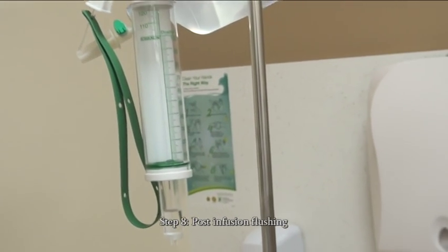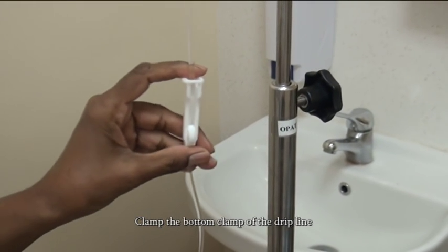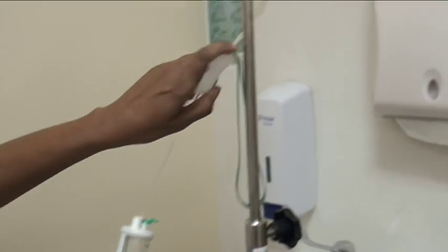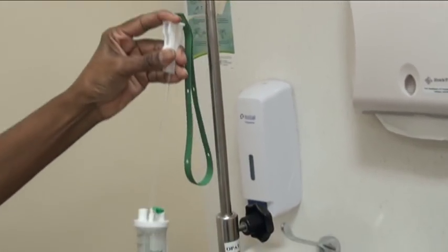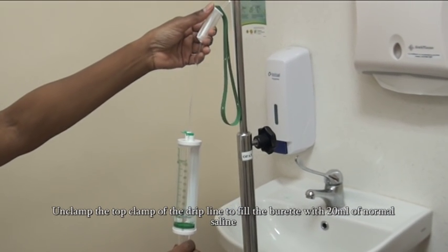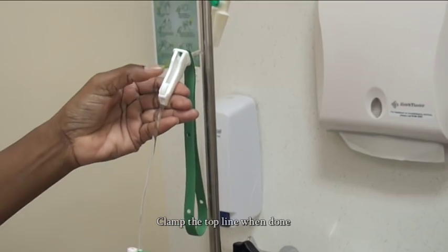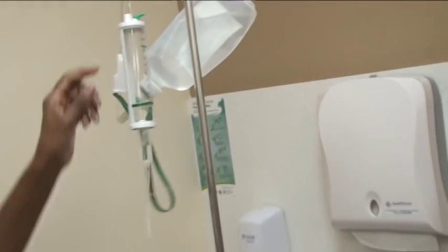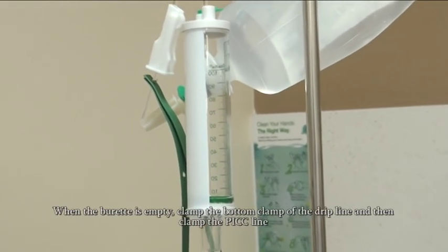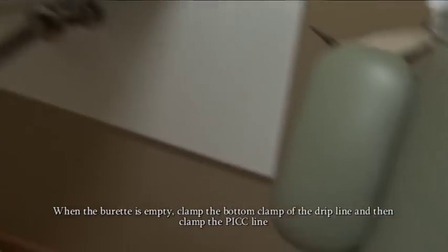Step 8: Post-infusion flushing. When the infusion has completed, the burette will be empty — clamp the bottom clamp of the drip line. Unclamp the top clamp of the drip line to fill the burette with 20ml of normal saline. Clamp the top line when done. Unclamp the bottom clamp of the drip line. When the burette is empty, clamp the bottom clamp of the drip line and then clamp the PICC line.